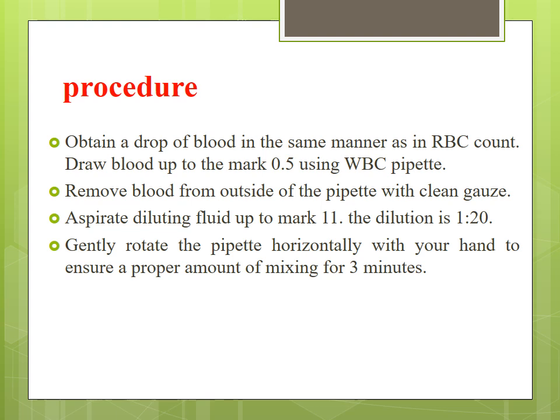Then aspirate diluting fluid up to the 11 mark. After drawing from the finger prick up to the 0.5 mark, I complete it up to the 11 mark with the diluting fluid, which is Turk solution. Gently rotate the pipette horizontally with your hand to ensure proper mixing for 3 minutes, to obtain the mixture of the blood plus Turk solution.